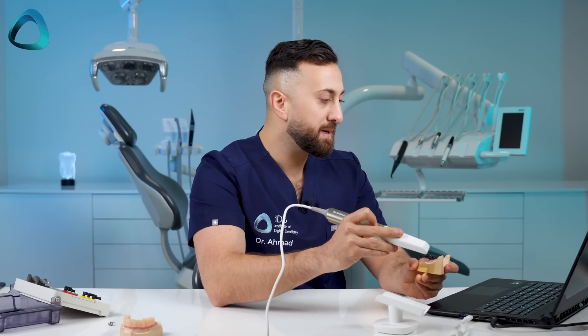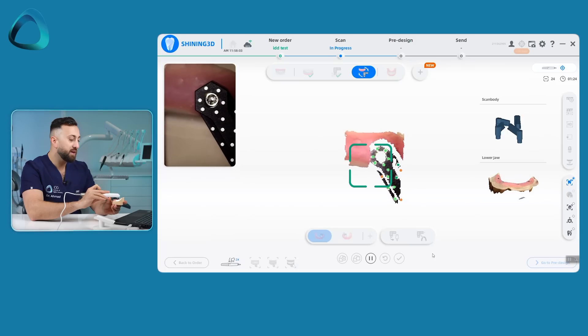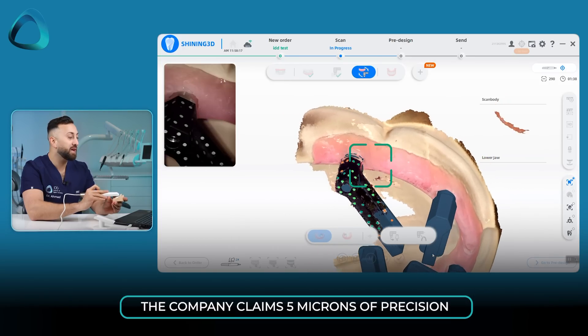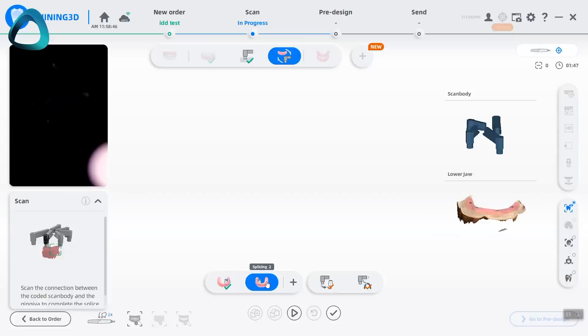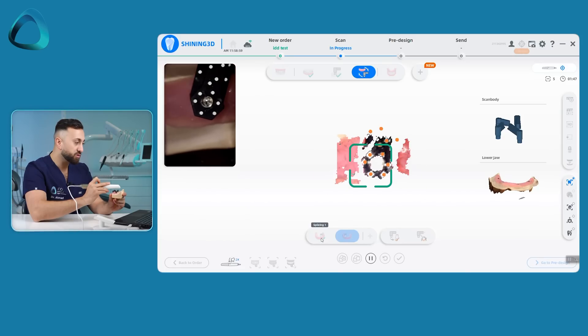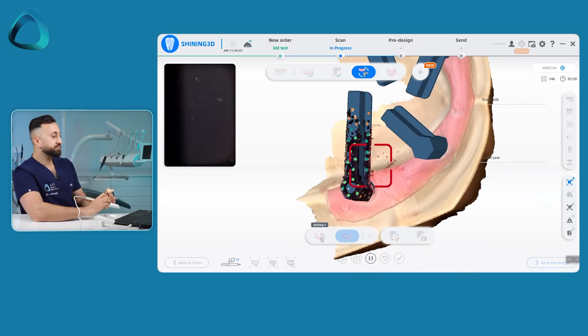How you do the alignment is quite cool. You start on one of these coded scan body kits, then just start scanning and it will recognize the whole coded scan body kit and align it. Then you roll down and capture some of that edentulous ridge and it will align it all together. Green shows you when it is recognizing that scan body and confirming on screen that it has been scanned properly. That is one splicing — you can add multiple splicings. You scan the right-hand side, and you can also scan the left-hand side starting on the screw, and it will align everything together.